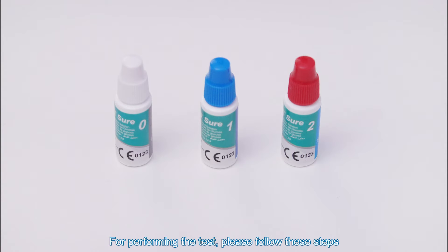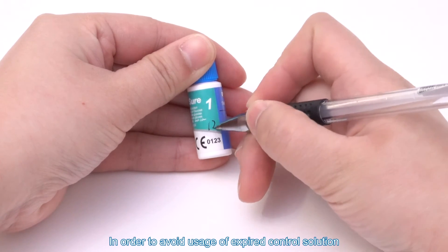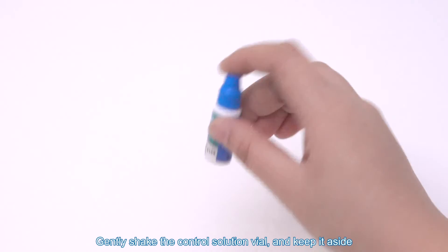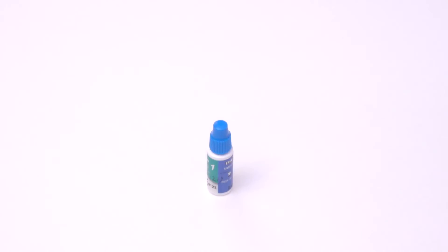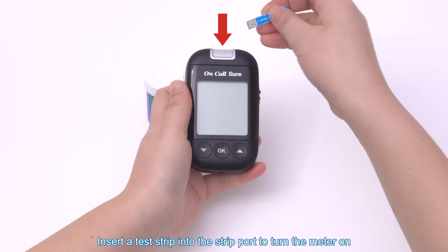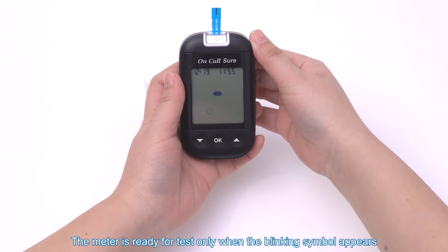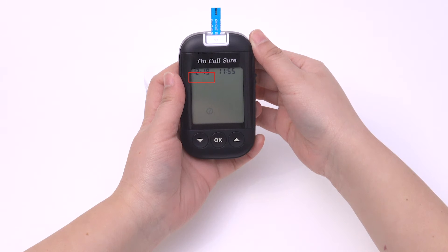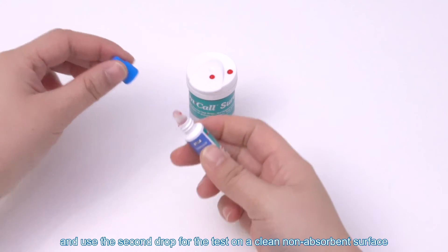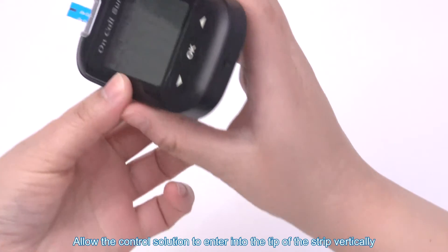For performing the quality control test, please follow these steps. Mark the date on the vial during the first opening to avoid usage of expired control solution. Gently shake the control solution vial and keep it aside. Insert a test strip into the strip port to turn the meter on. The meter is ready for test only when the blinking symbol appears. Discard the first drop of control solution and use the second drop for the test on a clean non-absorbent surface. Then close the bottle tightly.